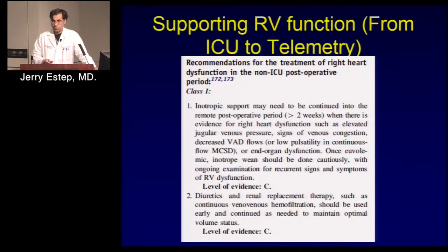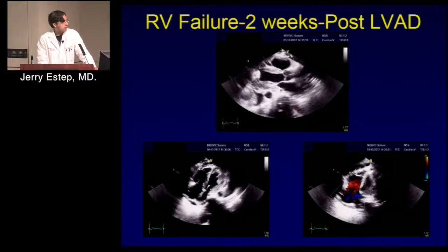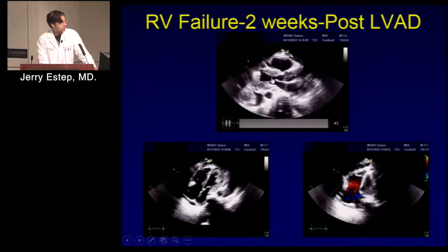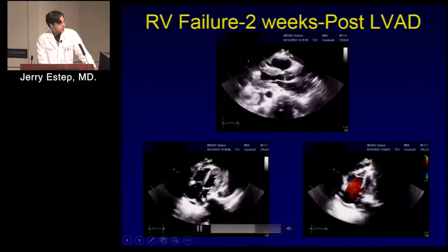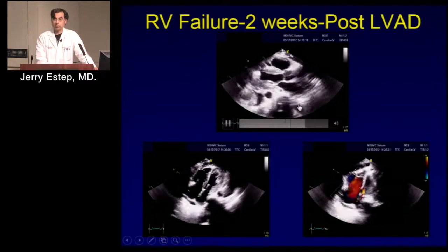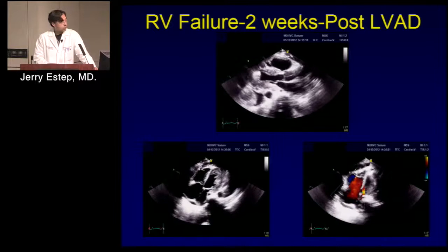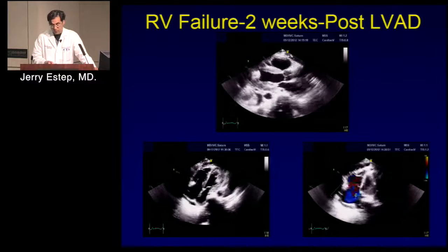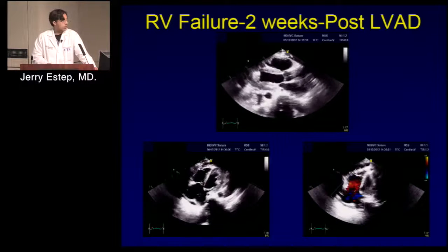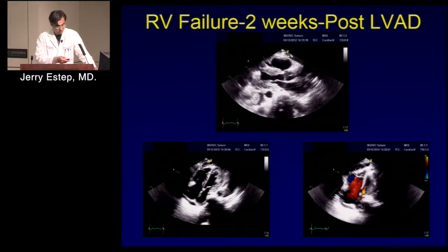Now, the patients transition to the floor. In RV failure, there is a spectrum. We have patients that we were able to get out of the unit but still have a relatively underfilled LV, interatrial septum bowing into the left atrium, significant TR, and this is a patient 2 weeks out with smoldering RV failure where we're using prolonged inotropes. And so the echo correlate to the clinical observations would be key. In this scenario, we want to wean the inotropes and see how he does clinically with kidney function, blood pressure. We may repeat an echo just to understand optimization of speed, which I'll get to.